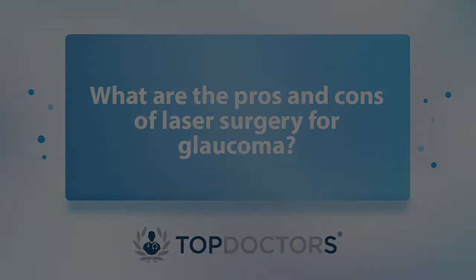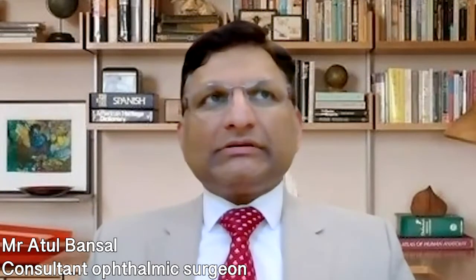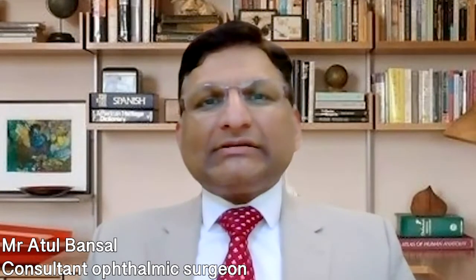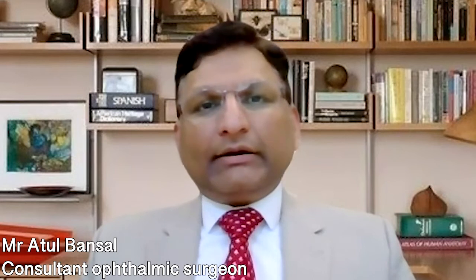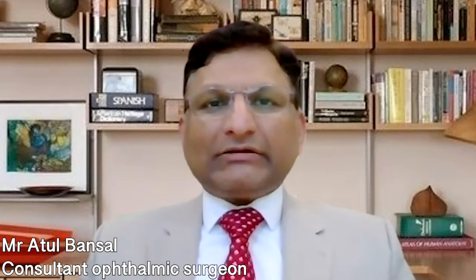Laser surgery is used most of the time as something that will cause fewer side effects, or will prevent a bigger surgery, which would have a higher chance of side effects.